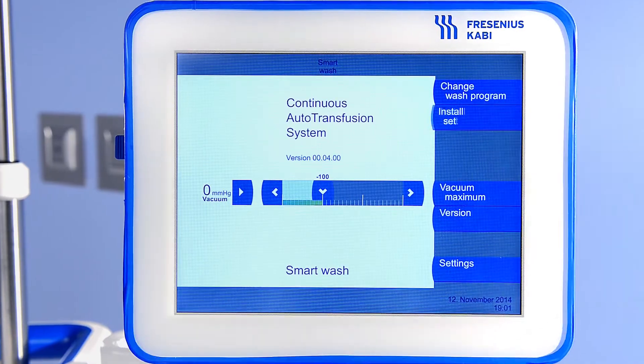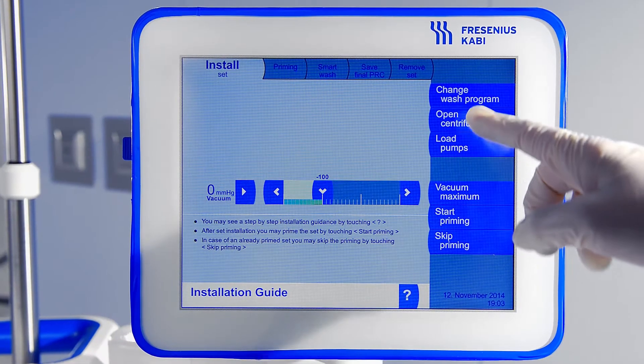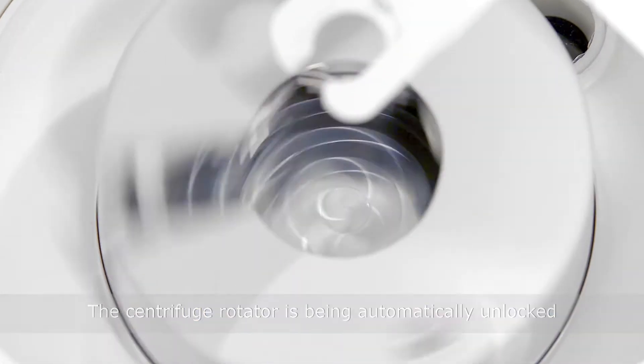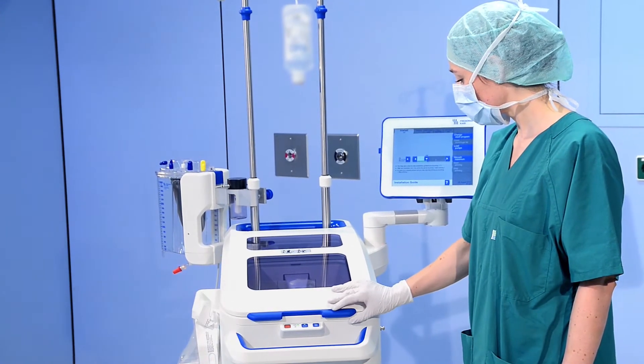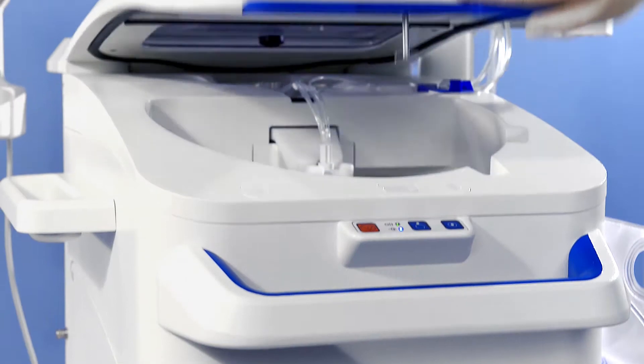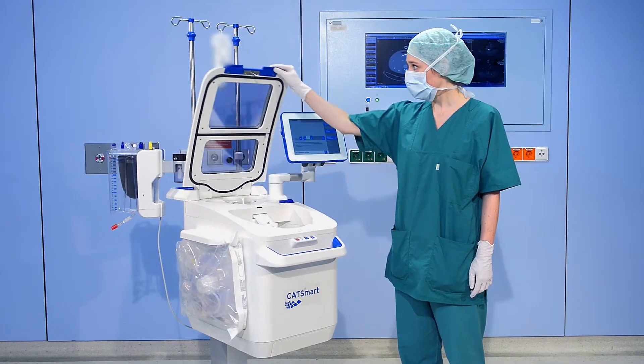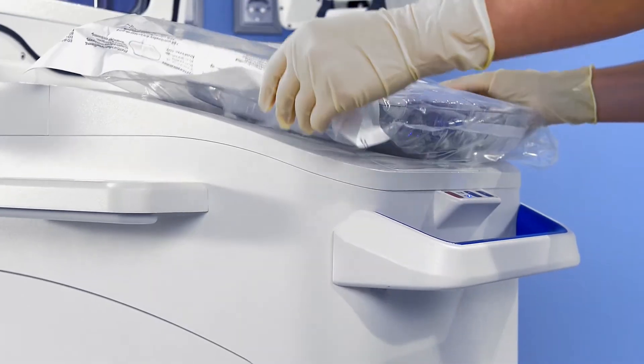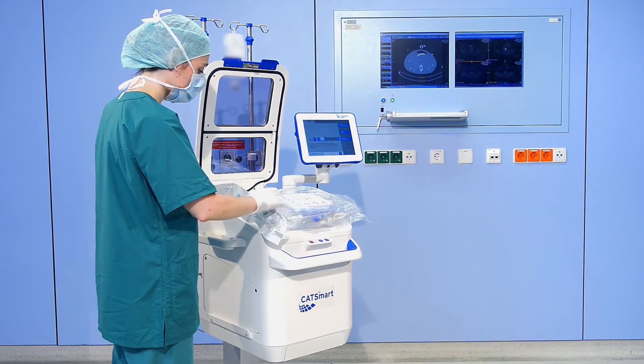Install the auto transfusion set by pressing Install Set. Select the function Open Centrifuge Lid. You might hear the mechanisms as a confirmation, and raise the centrifuge lid to the right position. Remove the packing shell from the packaging and place over the centrifuge chamber with the auto transfusion set.